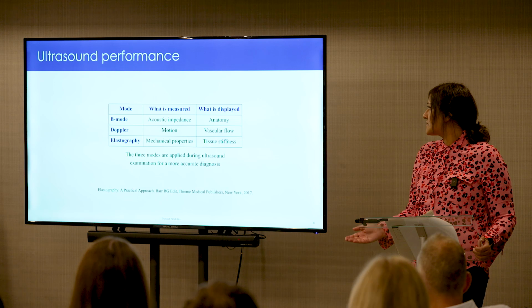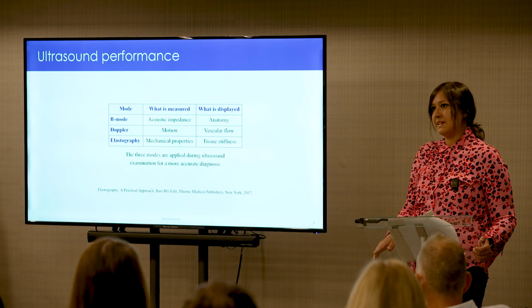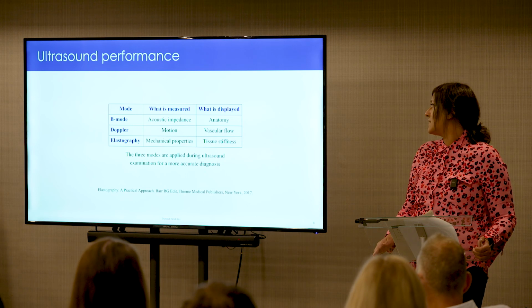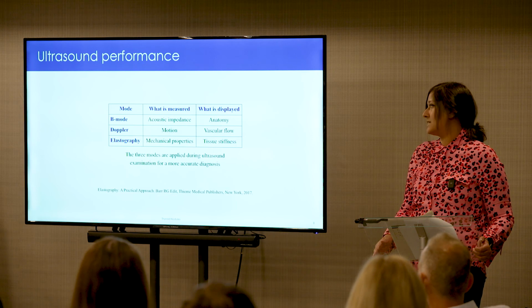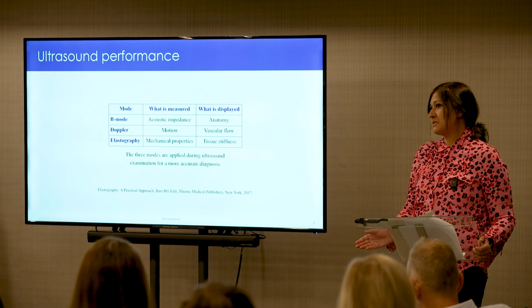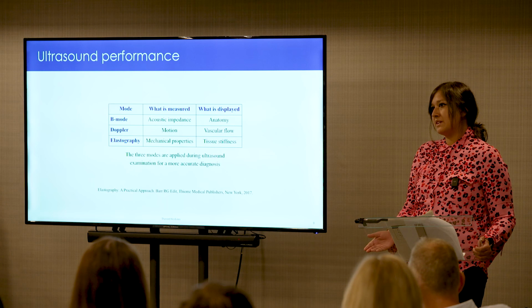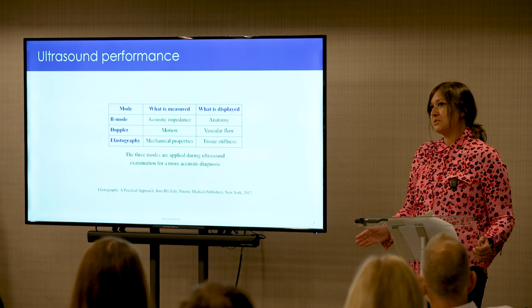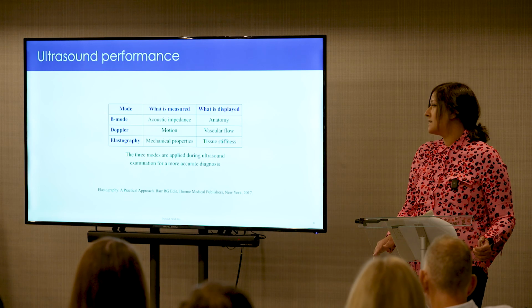I've mentioned elastography here, but this is actually not something that we use at MFT. I believe the evidence isn't fully out from the ELATION trial, which was a large-scale multi-center randomized controlled trial. So there's not really much evidence to support the use of elastography in assessment yet. But if you were to use it, it would just evaluate the stiffness of a nodule, where a higher stiffness is thought to correlate towards a more malignant feature generally for any part of the body, really.